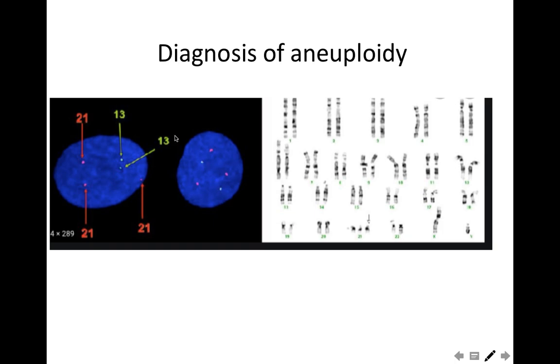Okay. This fish test is very rapid and very easy to perform for cases in prenatal diagnosis of aneuploidies. Later on it will be confirmed by the karyotype. Okay, so it's like a preliminary test because it's easy and quick.